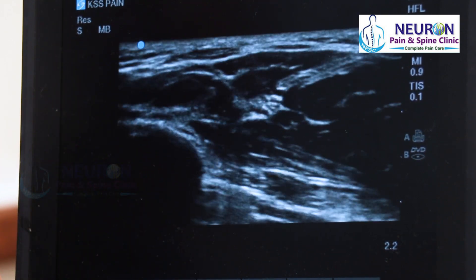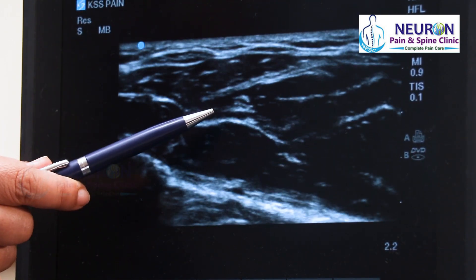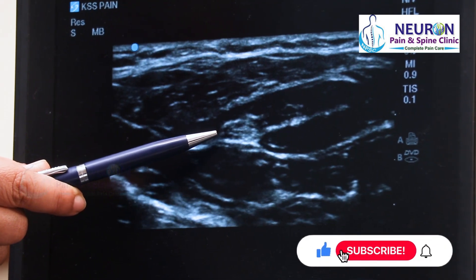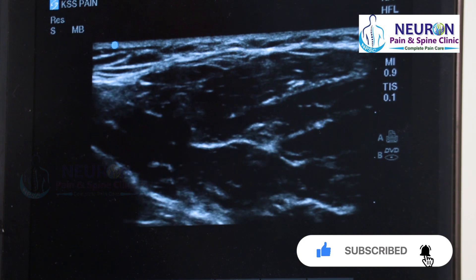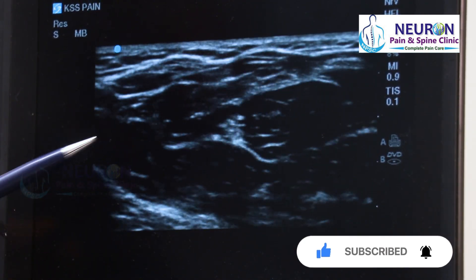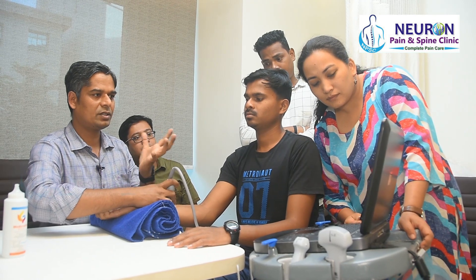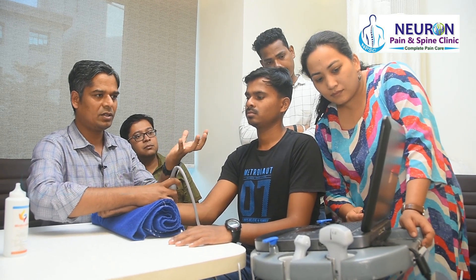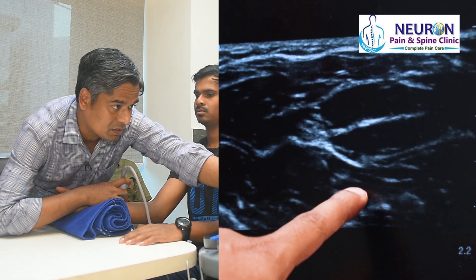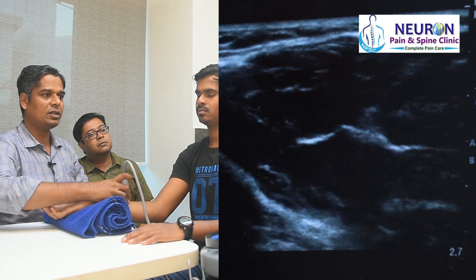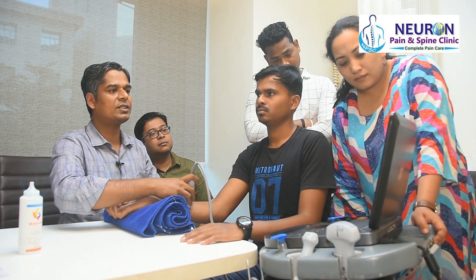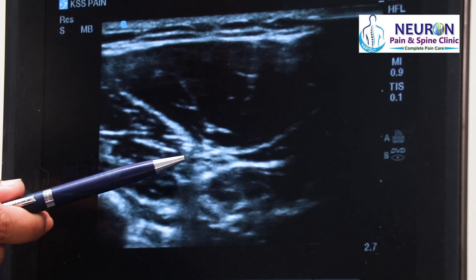I'm slowly going up. See the median nerve? That is the median nerve. If you move the thumb, that muscle is flexor pollicis longus. Fingers moving — this muscle is flexor digitorum superficialis, flexor digitorum profundus, the deep muscle. The nerve is traveling between these two muscles. I'm slowly going up. You can see the median nerve there.